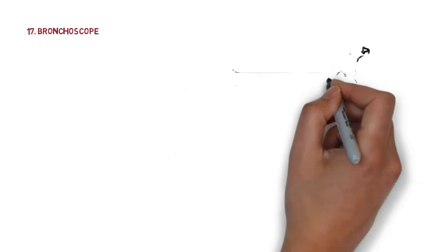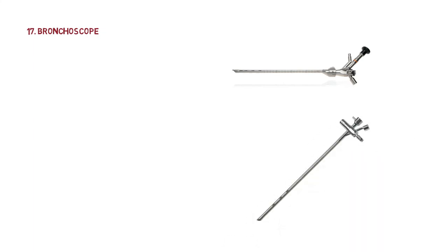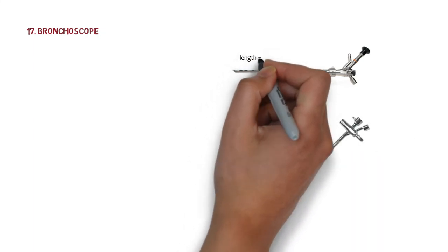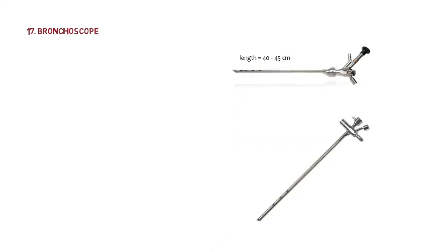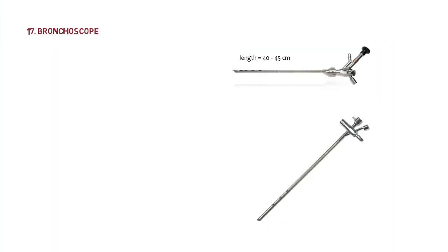The next instrument is the bronchoscope — a hollow rigid tube with a beveled end, about 40 to 45 centimeters long. It has vents on the side which are used for ventilation of the other bronchus. This distinguishes it from the esophagoscope, which has no vents; the bronchoscope has vents present for ventilation.